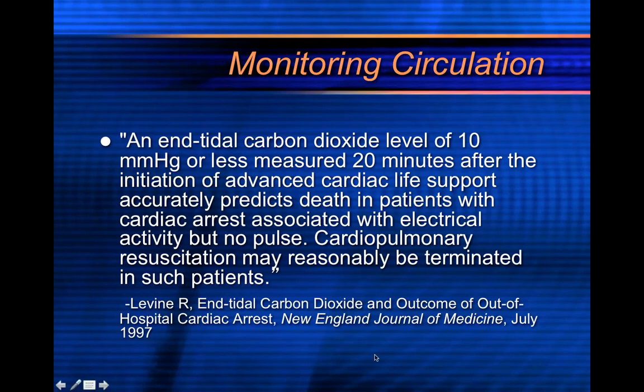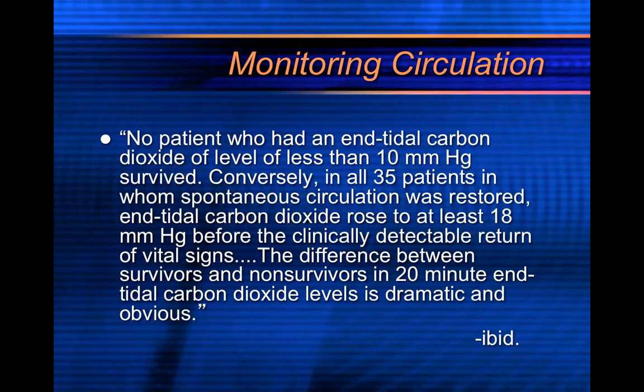Here's some research. You can read over this if you want. If you have a value of 10 or less for your cardiac arrest patient, if you never come above the value of 10 millimeters of mercury for an end-tidal CO2 reading for a whole 20 minutes of working a cardiac arrest, you need to consider termination if your system will allow you to do that, because this patient will not survive according to the literature. So values of less than 10, 20 minutes into a cardiac arrest resuscitation effort will not be correlated with a survivable patient or a viable patient.